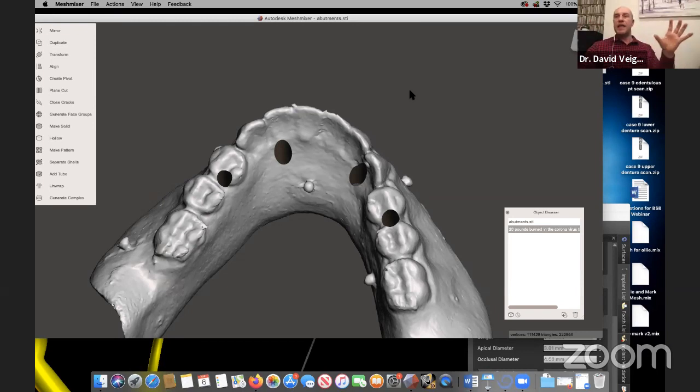So once I've got that prosthesis that the patient exactly likes, and I've made a copy of it with the two 3D printed versions, that then gets invested into a silicone matrix, which is then frame is made within that, and then composite is wrapped on top of that. And the final prosthesis that comes from that is exactly the same as the 3D printed try-in. The shapes are exactly the same because it's been made from the essential scaffold that the patient has had in their mouth. That's a relatively quick walkthrough of that.